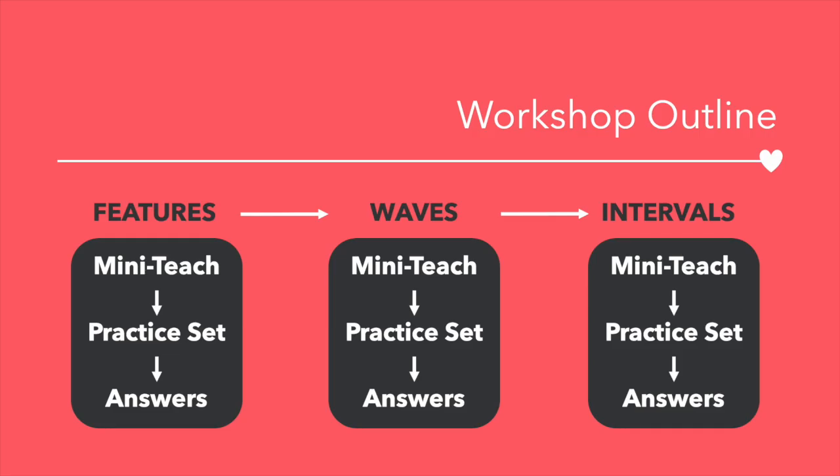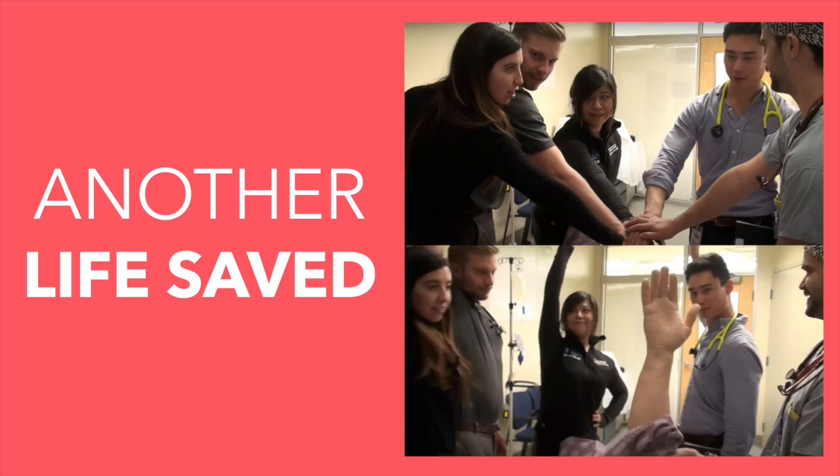Once all 3 sets are done, I'll present you with a final ECG where you can then analyze all parts together. I hope you enjoy this workshop, and I think you'll find it a comprehensive review of all parts of the ECG. By committing to practicing interpreting ECGs, you can save a life.